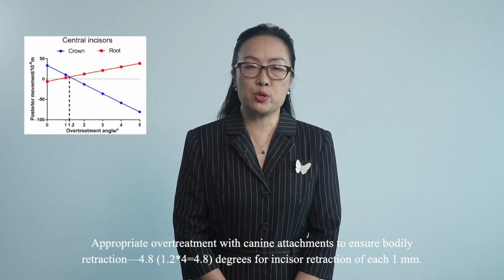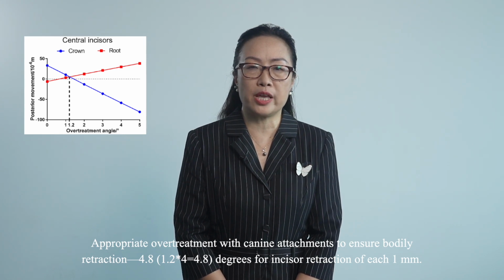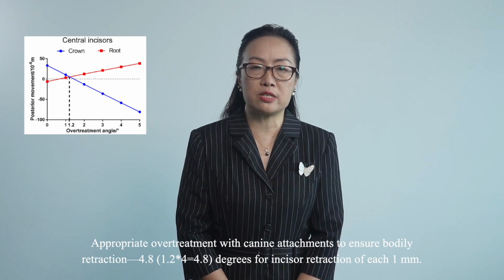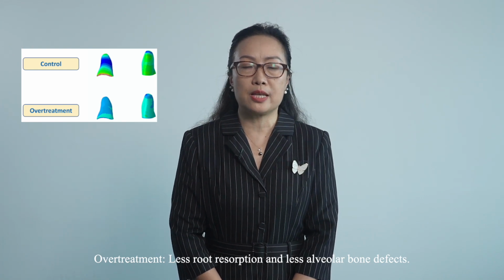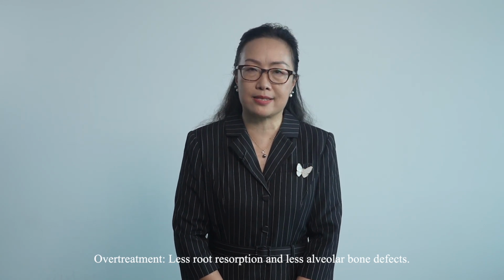Appropriate aligner overtreatment with canine attachments should be designed to ensure bodily retraction. For incisor retraction of 1 mm, 4.8 degrees of overtreatment should be designed for this model. Appropriate aligner overtreatment with canine attachments should be designed to reduce the likelihood of root resorption and alveolar bone defects.